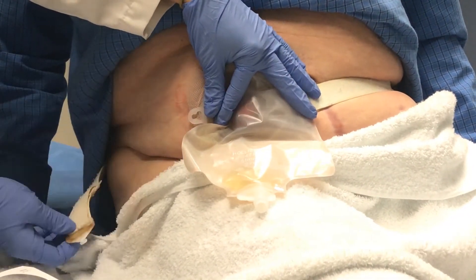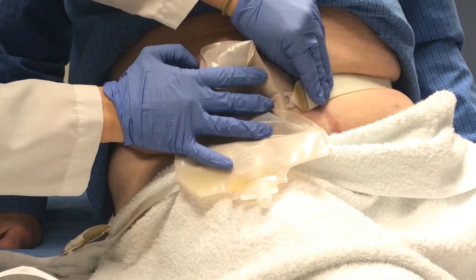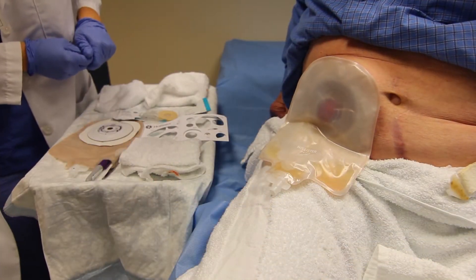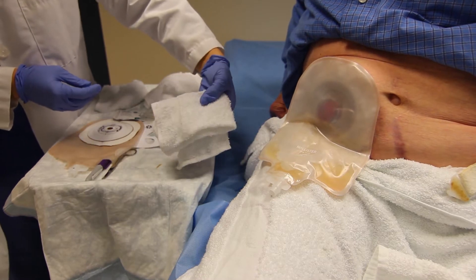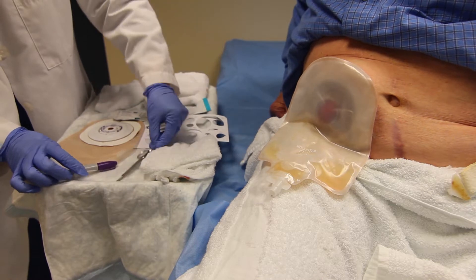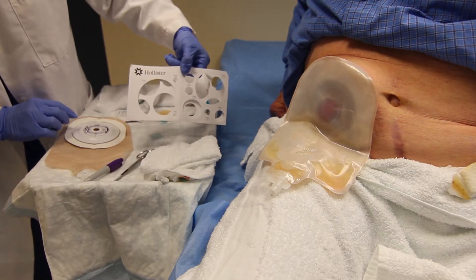If you have a belt, please remove the belt. Then gather your supplies. You will need a washcloth, pen, scissors, pouching system, and a stoma measuring guide.